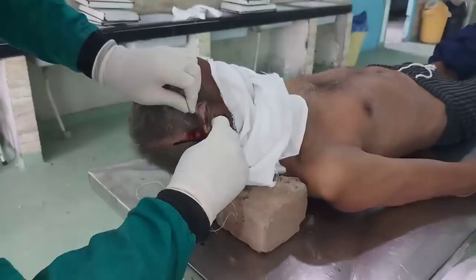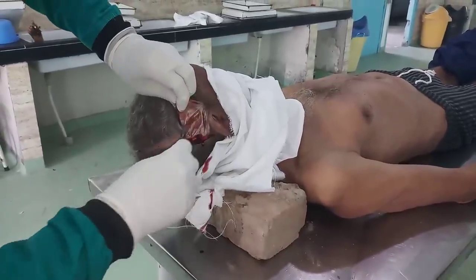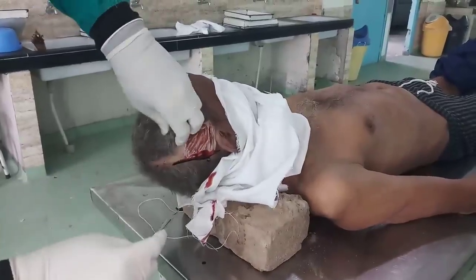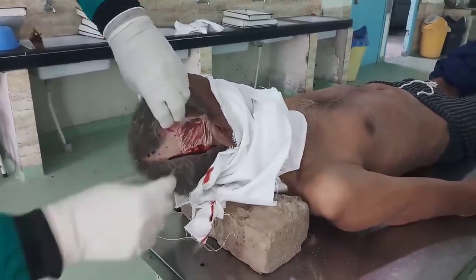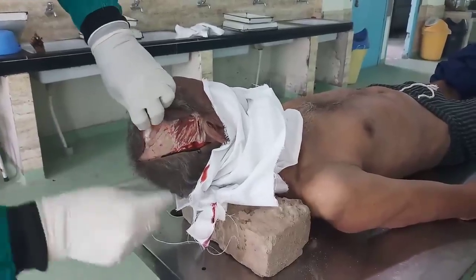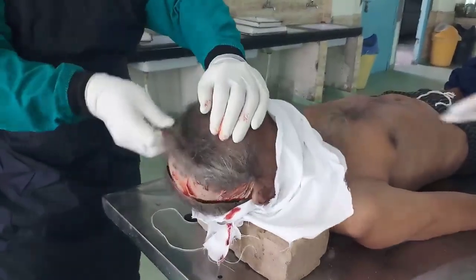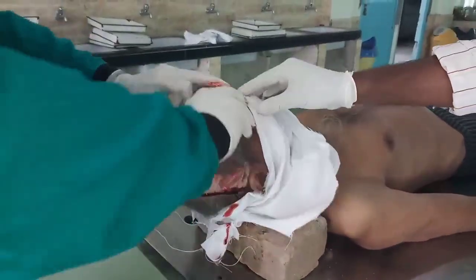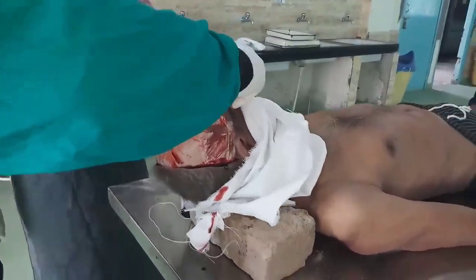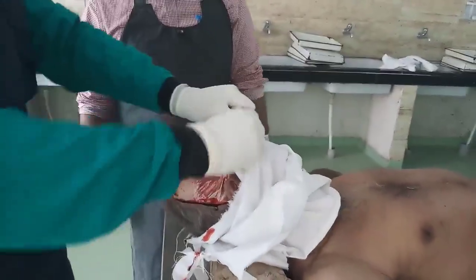Now this anterior flap will be retracted forward. See, we are retracting the anterior flap. We should do a little bit of blunt dissection with the finger because that gives a better result compared to the knife, like this.